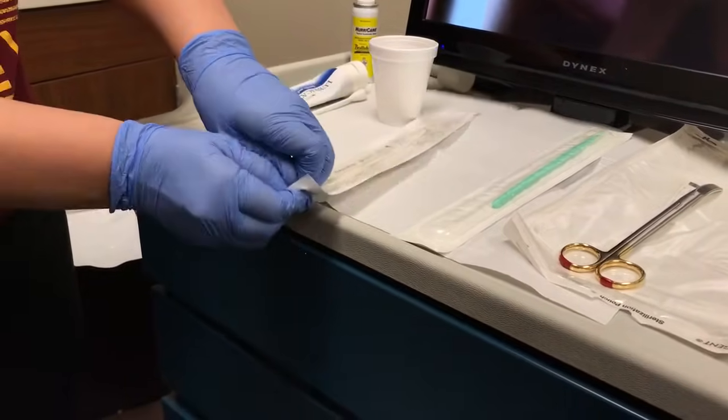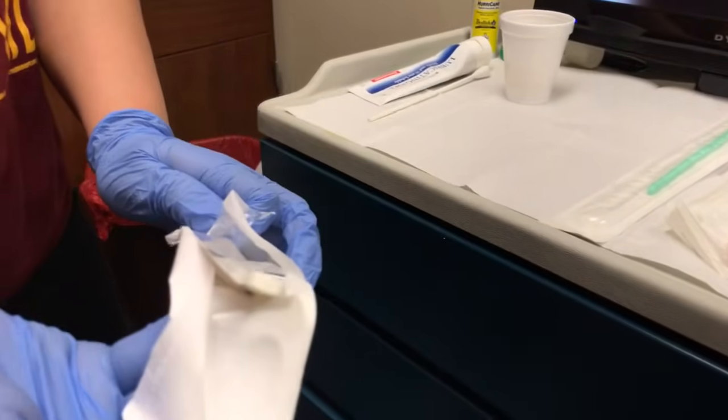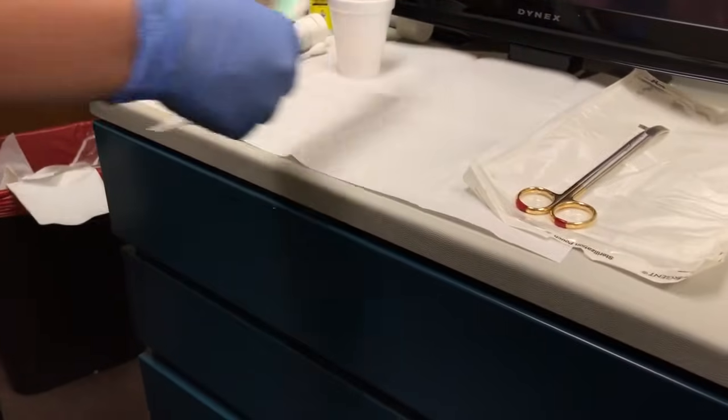After the provider puts on their sterile gloves, the medical assistant will then open up the fundus sound and also the cervical dilator.